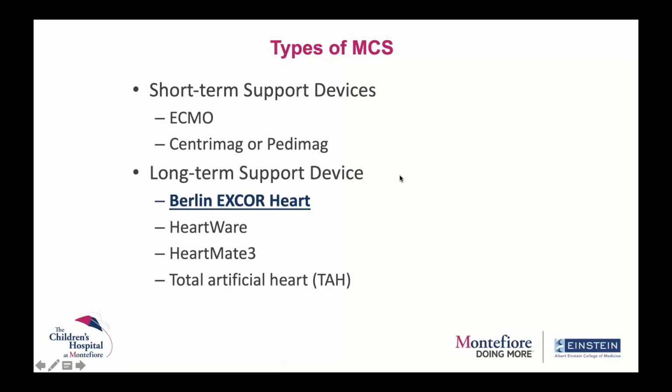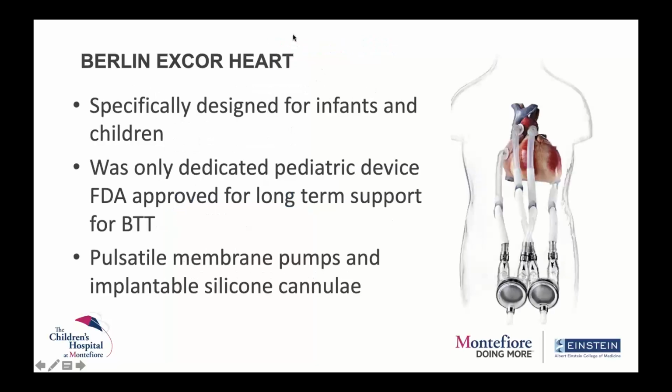So then let's talk about some long-term support devices. I have the Berlin EXCOR next. Berlin EXCOR is specifically designed for infants and children. It was the only dedicated pediatric device that was FDA approved for long-term support as a bridge to transplant, till very recently, when we got the HeartMate 3 that also has a pediatric label now.